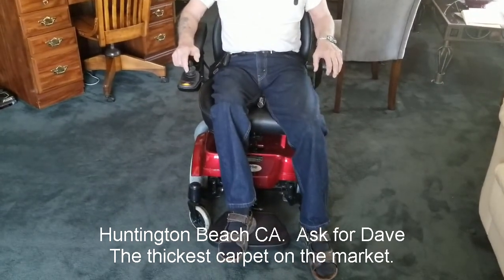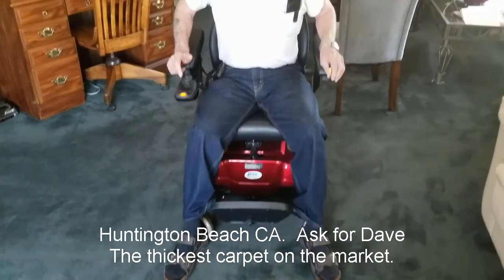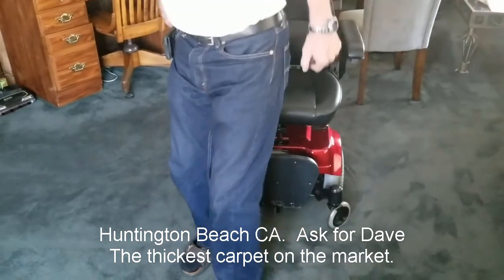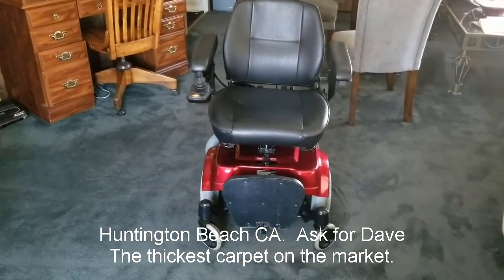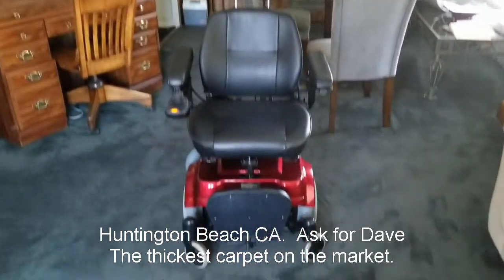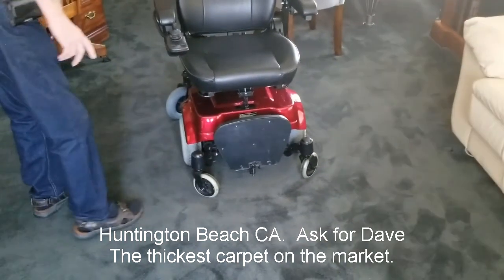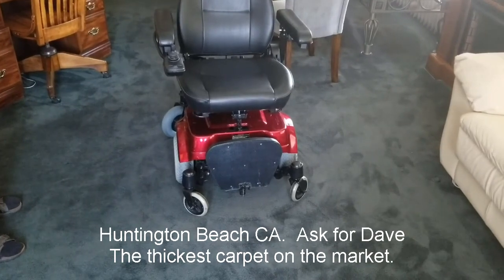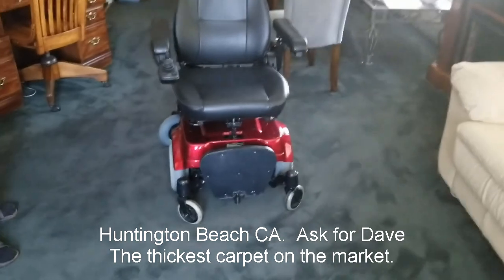So we're going to sell this for $600 starting. We bought it for $700. We rarely used it. And we bought it, again, for my sister, who didn't have it very long — she passed away. Like I say, it's in good condition and it's a good price. I don't think you could beat the price. We live in Huntington Beach, California.